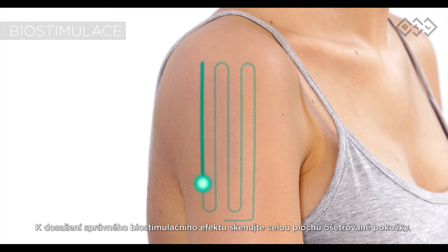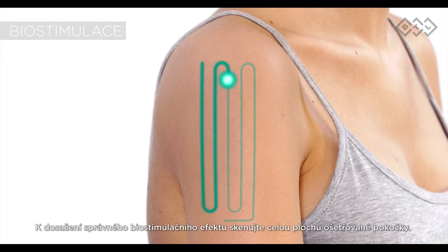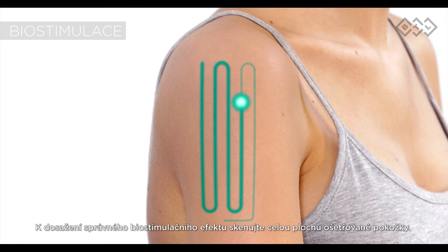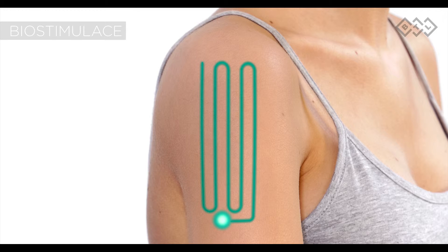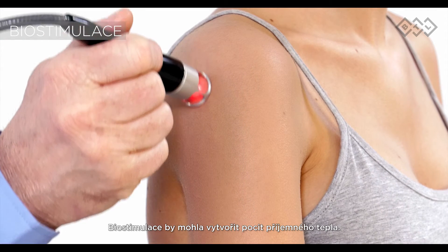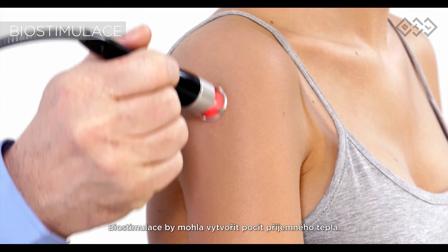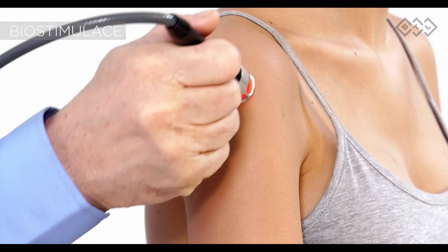To reach the proper biostimulation effect, scan along the treated area filling all its parts. Biostimulation should create a pleasantly warm sensation. Do not apply statically.